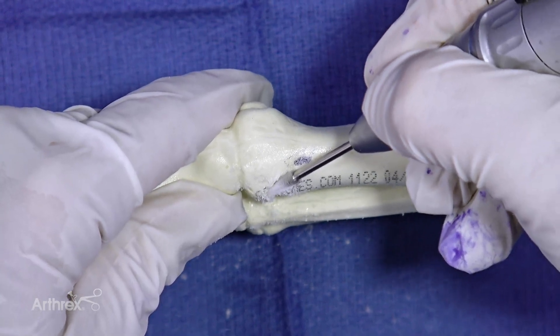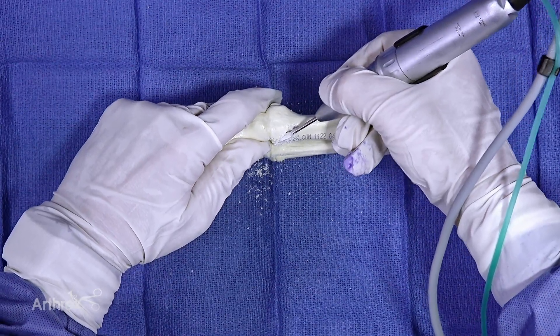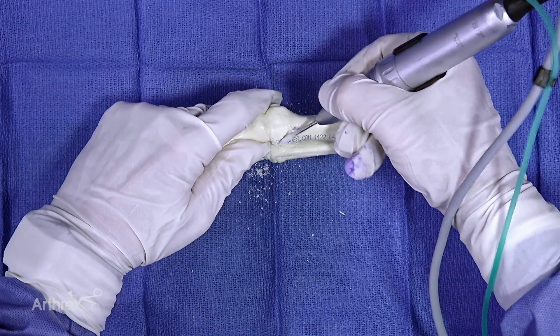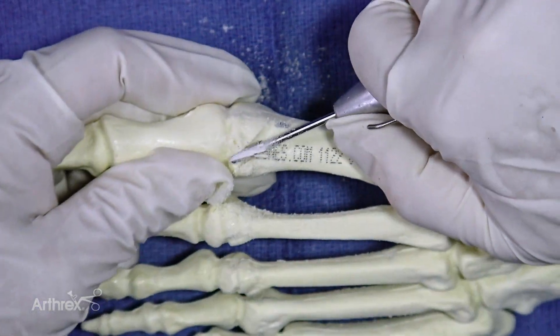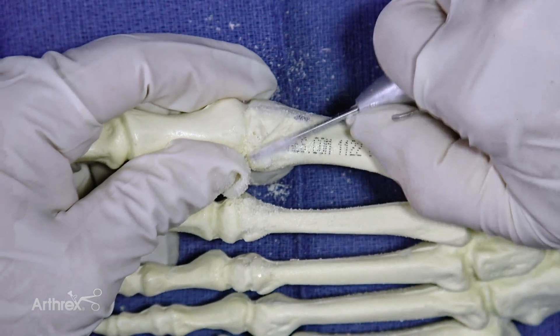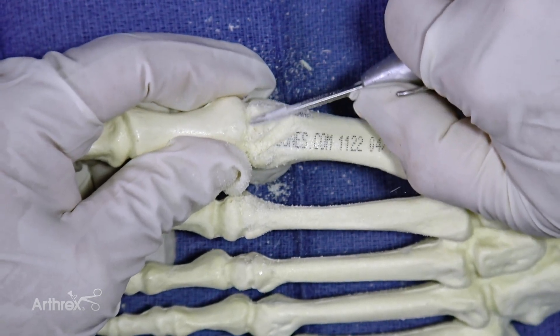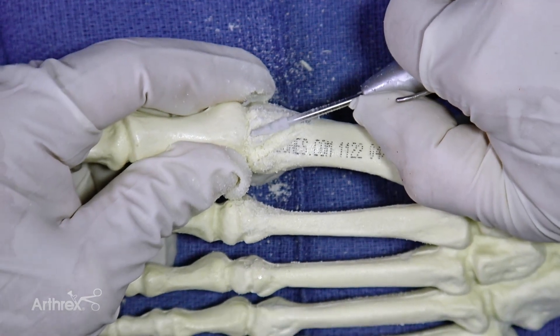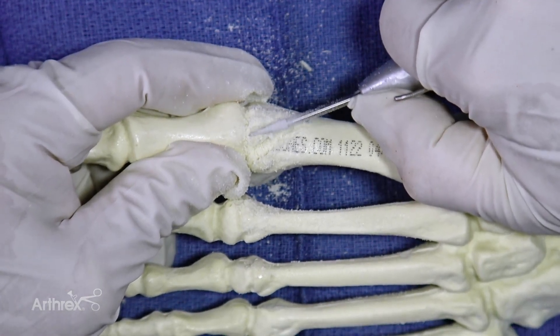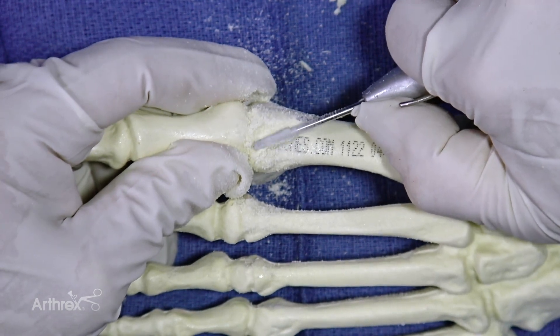You can also switch to the farmer's grip and basically kind of peel the onion, if you will, and finish that off.